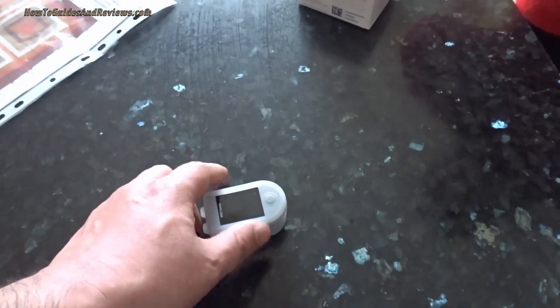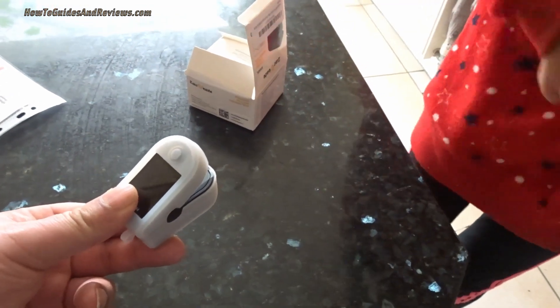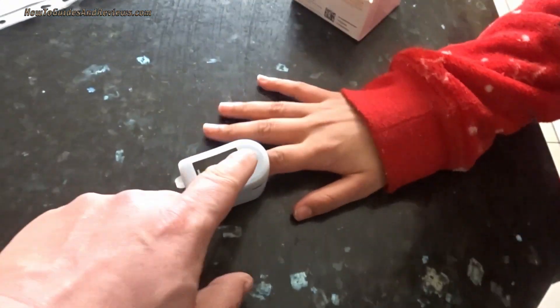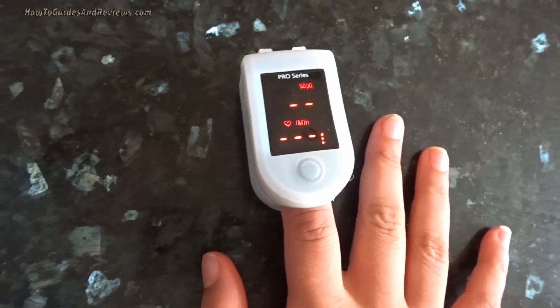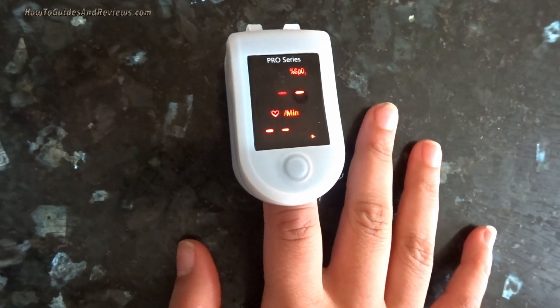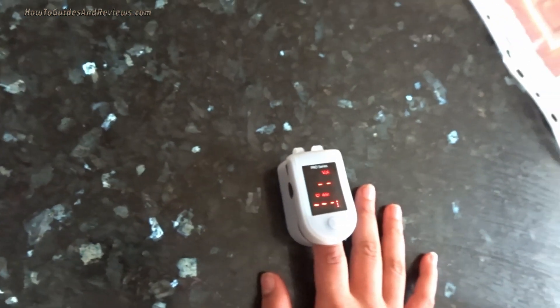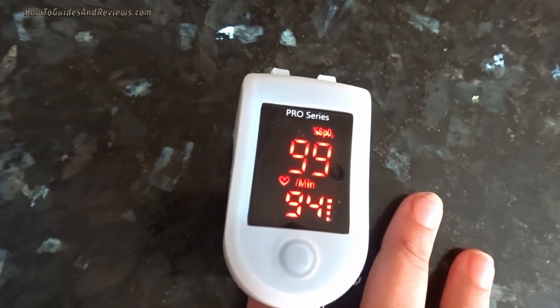Come on in, let's test. How old are you? 12. Right, put your finger in — right to the end. Let me turn it on. It might not read for children, we'll see. Yours should be 100%; your mum's was 98% normal, mine was low. It's reading 99%! Yeah, that's what it should be.